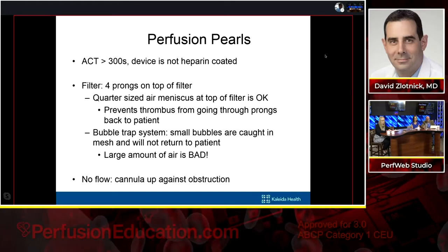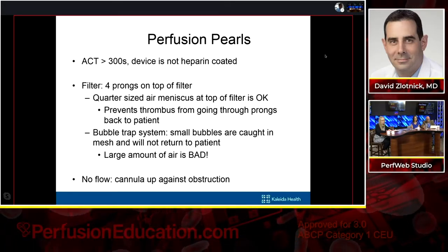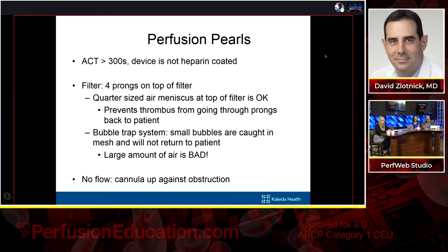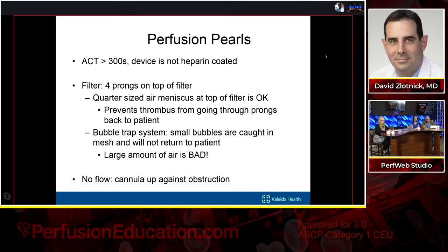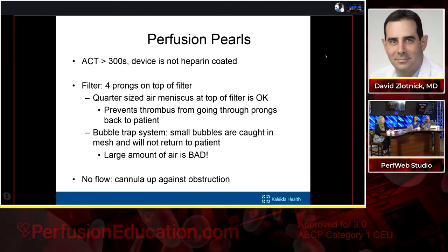And a quarter-sized meniscus of air is okay. This allows us to trap the thrombus, so make sure it doesn't go through the prongs and back to the patient. And the bubble trap system will capture small bubbles, so it's not going to return to the patient and cause a lot of problems. However, a large amount of air, as in any perfusion circuit, is bad. And I want to make sure I capitalize that, bad, for that one.